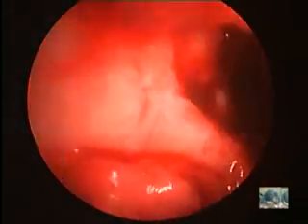Okay, any further question about this patient? Any question from the floor? Sham, normally, if you haven't done it, will you choose the canine fossa approach or use the inferior meatal approach for the sinoscopy? Normally, I would use the inferior meatal approach because a lot of patients after canine fossa approach complain about paresthesia of the cheek and some swelling postoperatively. So I would prefer the inferior meatal approach.